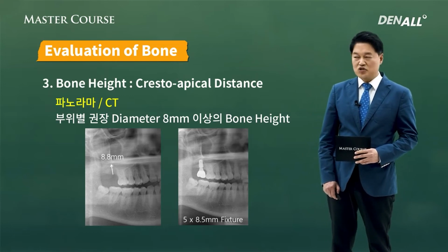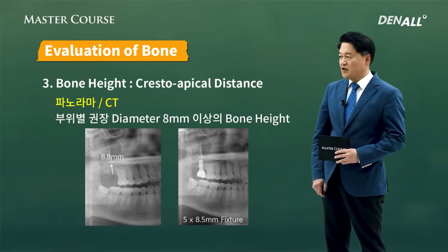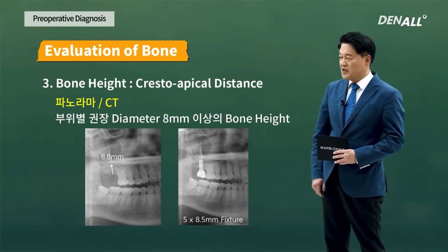There's approximately 8.8 millimeter bone height. You need to place at least 8.5 millimeter, so you need to do a socket lift and place an 8.5 millimeter length fixture.